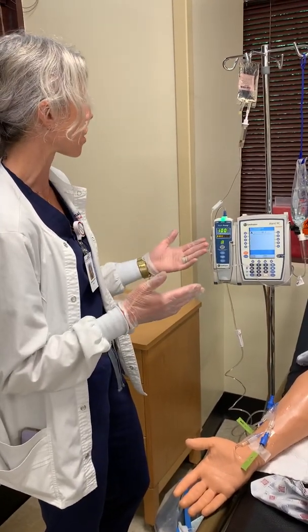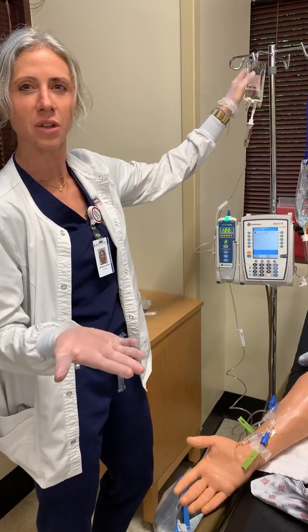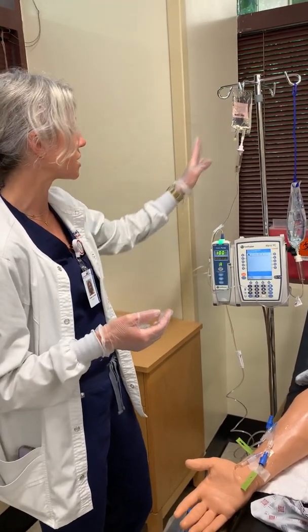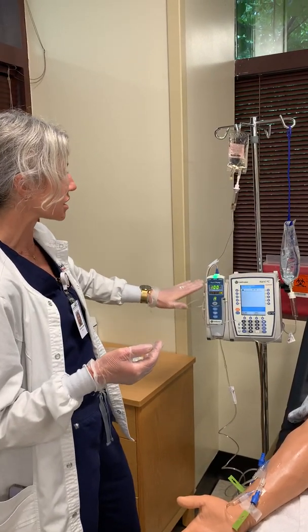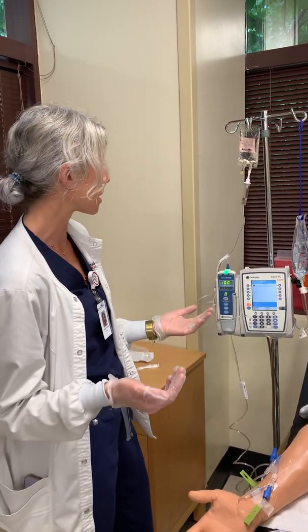Once I find that everything's running good, then what's gonna happen when this secondary is done? What do y'all think is gonna happen? It's going to resort back to the primary, okay? That's what the machine is gonna do. In an hour, when he's finished getting his vancomycin, it's gonna go back to this. So when I come in here, it's then gonna say 125 and it's gonna tell me what's running, okay? So that's how we run a secondary.